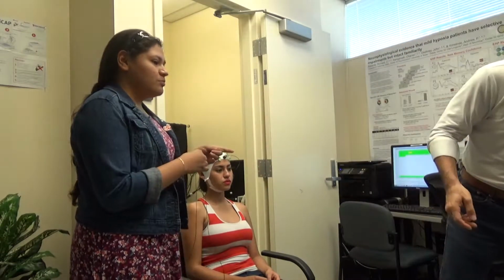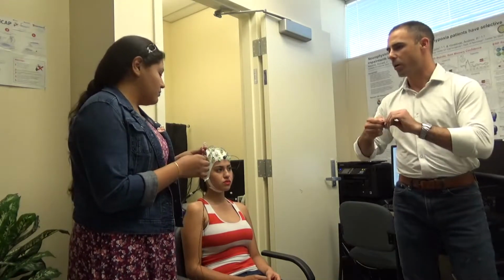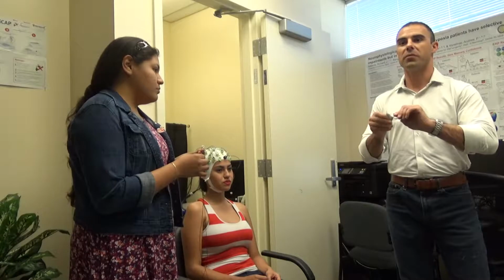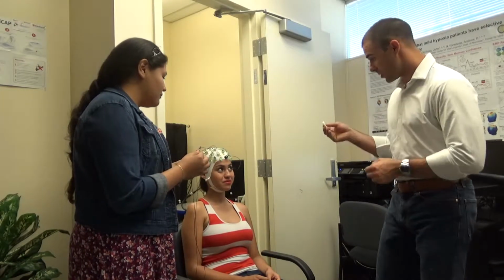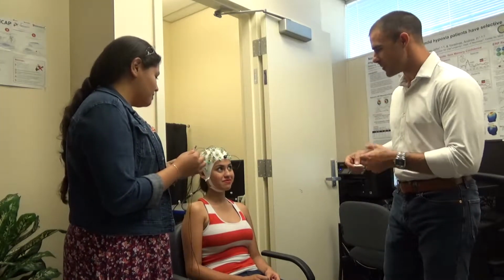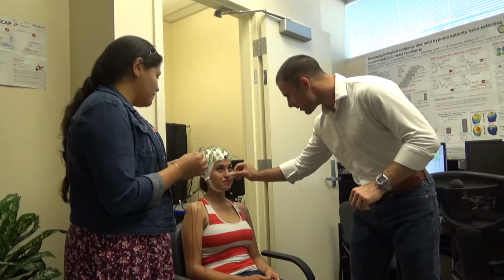Because what we need to do first, before we do that, is use a little alcohol swab to basically clean off the site where we're going to tape those on so that the tape sticks. Sometimes guys' faces are really sweaty or girls' faces have a lot of makeup on them and the sticker won't stick. So we just tell them we're going to use a little bit of alcohol, probably smell a little bit of fumes for just a second. But we'll just clean off that site underneath the cheek.